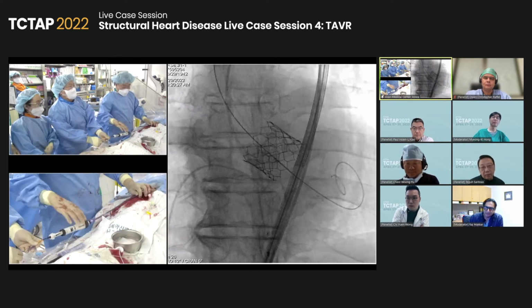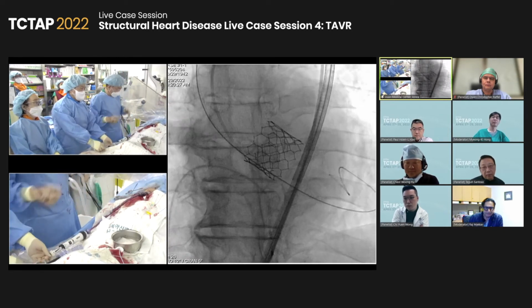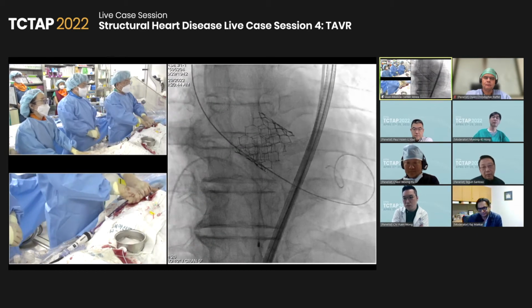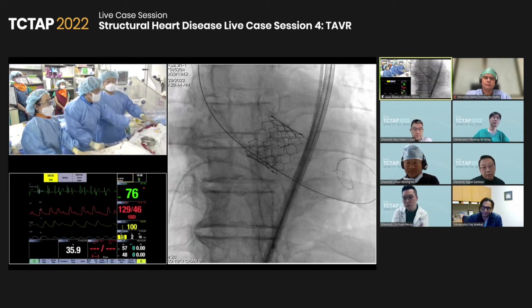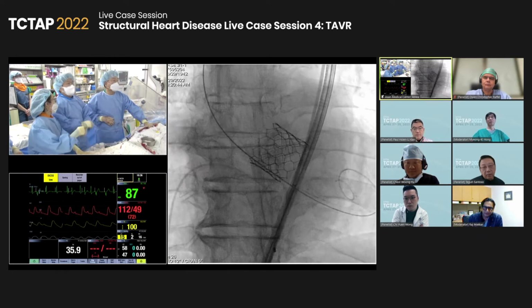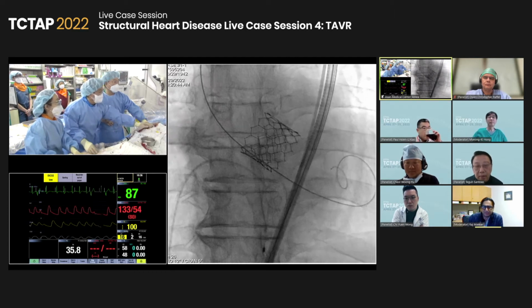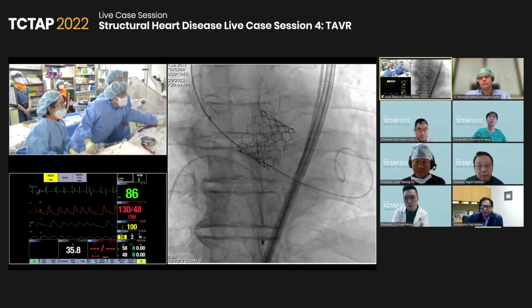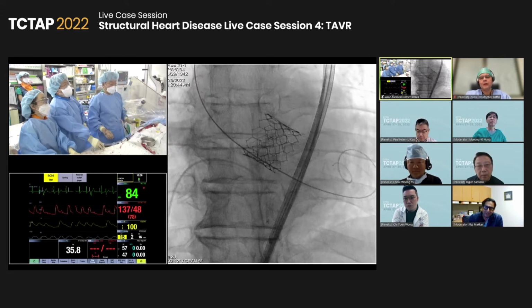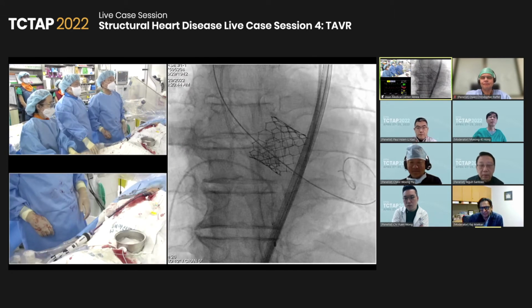Okay, I adjust, prevent pull back, and pull back in and adjust, just to fix the device itself. But during the inflation, that is only my role. Did you empty the whole volume? Yes. Okay, so this was plus 2. It takes us some time because 29, usually, okay.